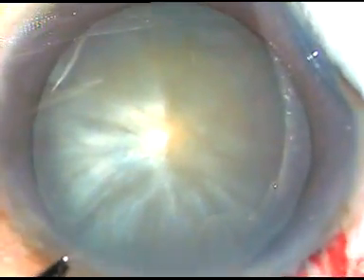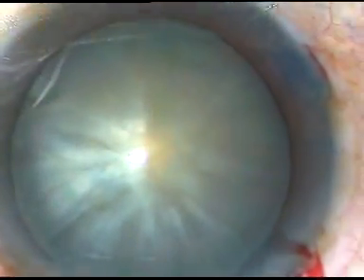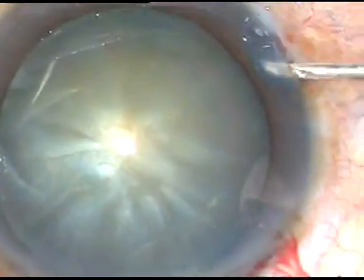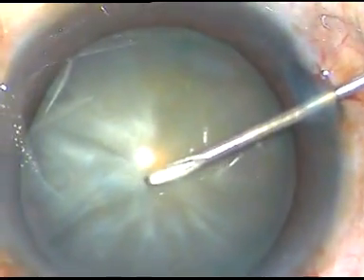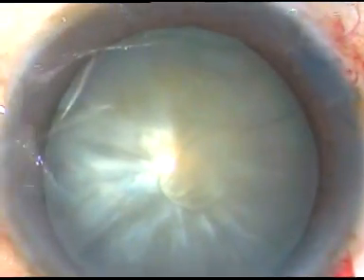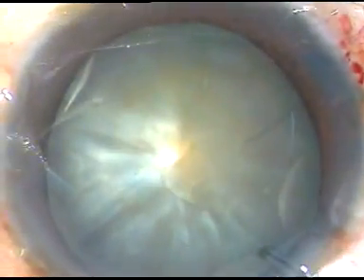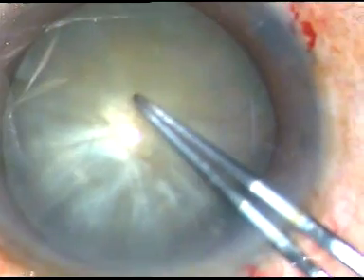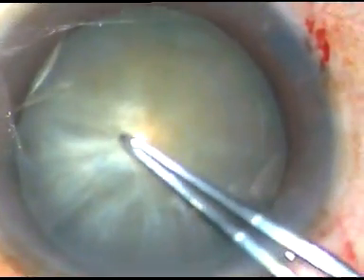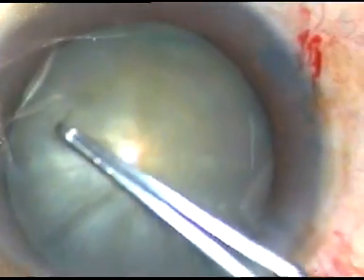This is the site on the left side for introduction of the chopper. Now I incise the capsule and make a C-flap. Since the staining is not good, it is difficult to see, but I was able to see through the microscope. Here I am making a very small rexis at this stage, which I call a mini rexis.